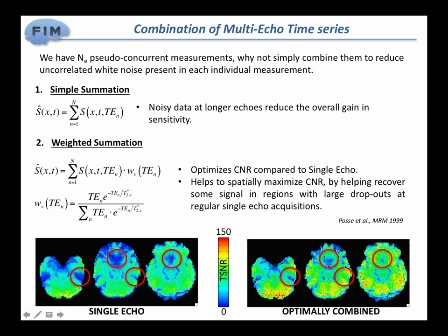And then you end up with a single time series, and you move forward with your analysis, whether you want to do a GLM, because this is an activity-based study, or functional connectivity and graph theory, whatever you want to do, you do it on this data, basically.